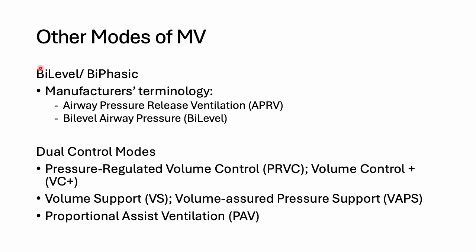Sometimes when you see patients on different modes, it's probably because the patient is hard to wean off mechanical ventilation, or the traditional modes cannot support the person's ventilation and oxygenation, and therefore the doctors want to try some of these advanced modes. So it really all depends on the clinician's or physician's preference.